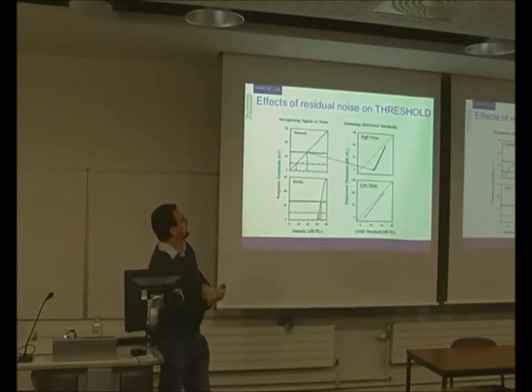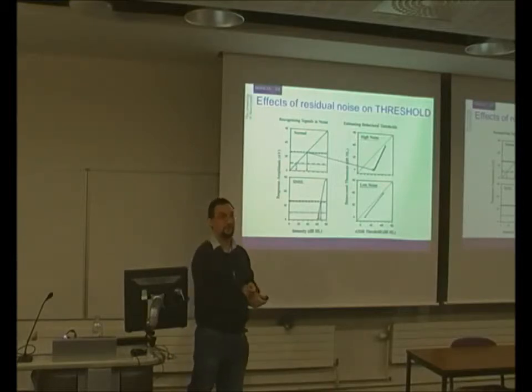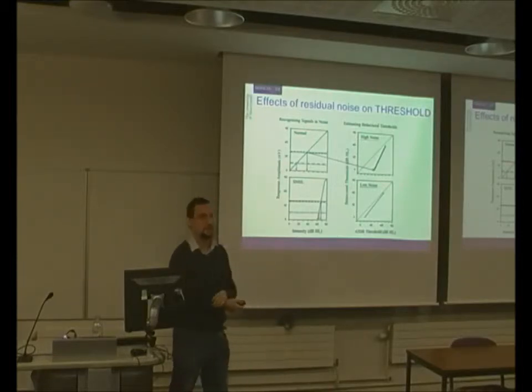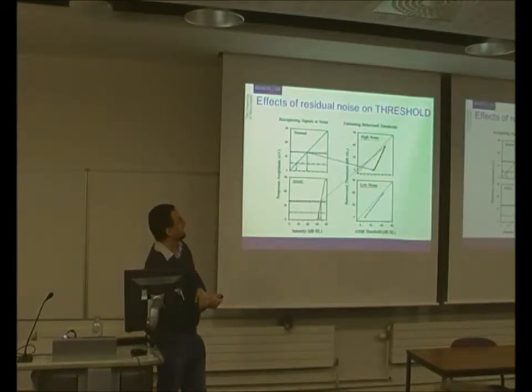So here's a normal hearing subject, and this is a high noise recording here. This dotted line here represents the noise. Anything below that, we couldn't detect because it's below the noise. So we end up with the threshold here. This is a match between ASSR threshold and behavioural threshold. So we end up with a very high ASSR threshold when their behavioural threshold is quite low, simply because there's too much noise in the recording and those amplitudes are too small for us to detect. And of course this applies to everything else, ABR too, the same principles apply actually.